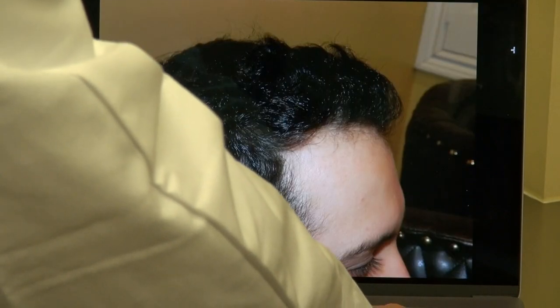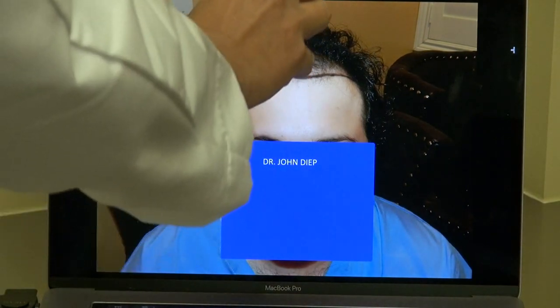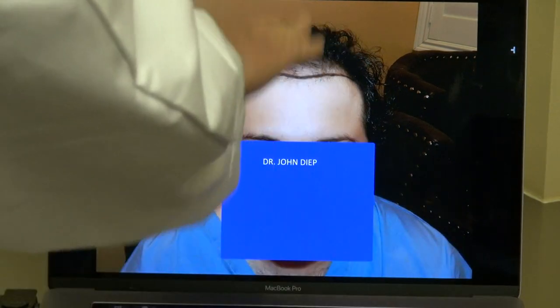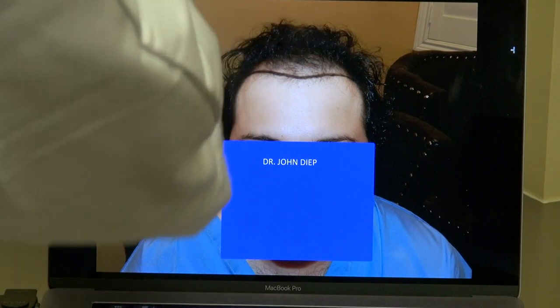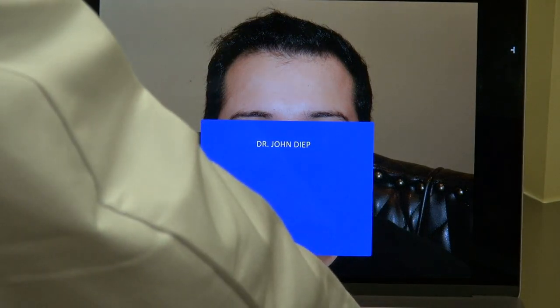To understand not just about the density, but there's art behind surgery as well. When you walk around losing your hair and your hairline has gone up, you tend to look older. What I do is dip his hairline in front and slightly curve from both sides. You see how soft and natural the hairline is — I give him a medium-soft hairline, and it's very natural.